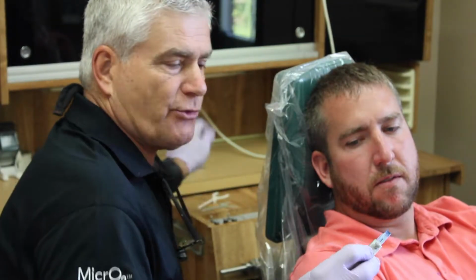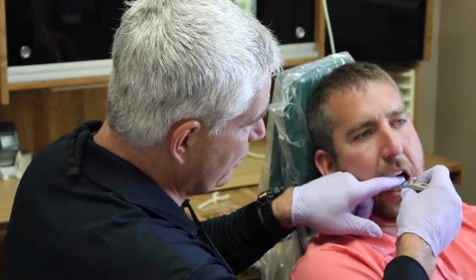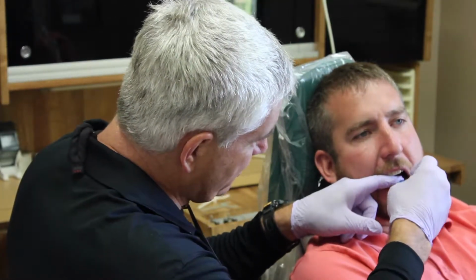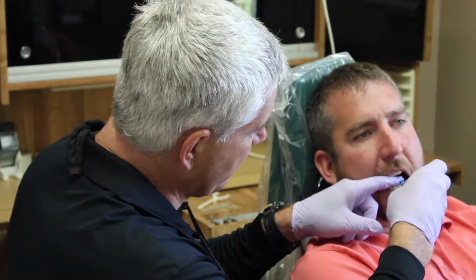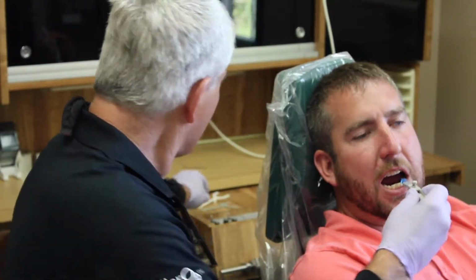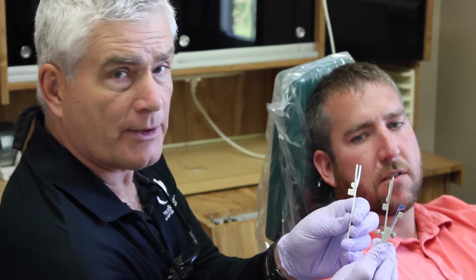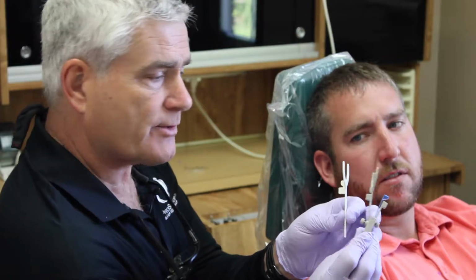So first I'll fit this little lower edge over Jeff's teeth. I'll loosen this, and I'll tighten this down across his teeth so that it fits comfortably. Feel all right, Jeff? Mm-hmm. I'll tighten that down. Excellent. And then I'm going to first take the gray, and they come in two different colors because the gray and the white have different thicknesses. You can see this little notch here is a little different on them, and they have different sizes.